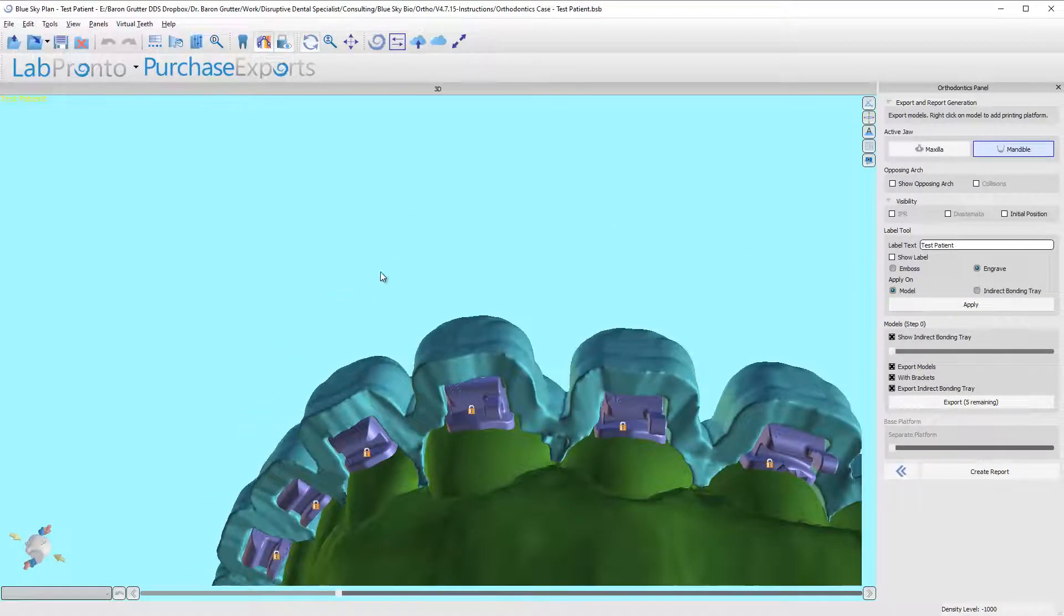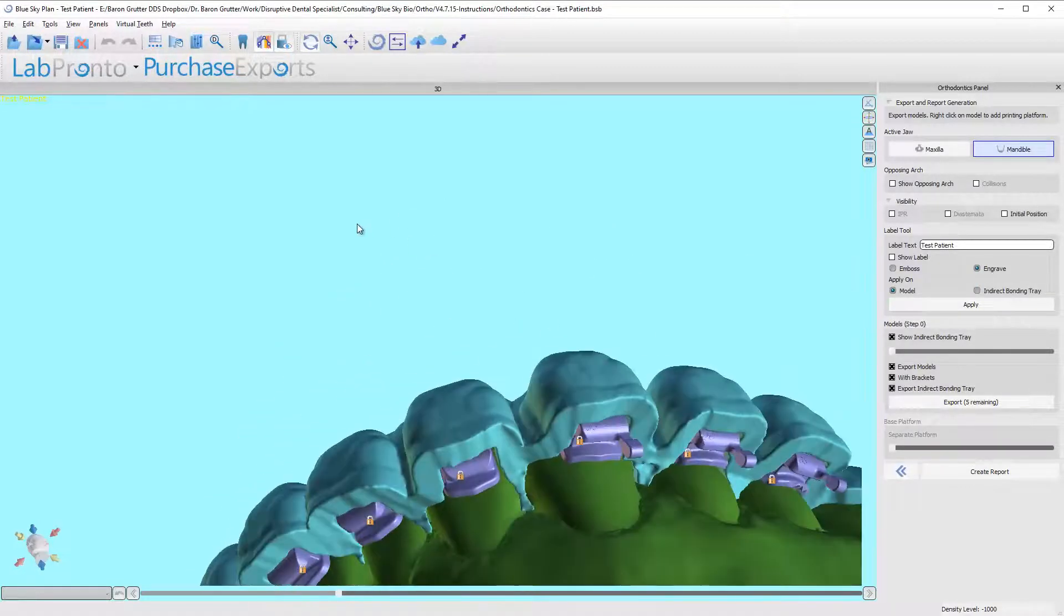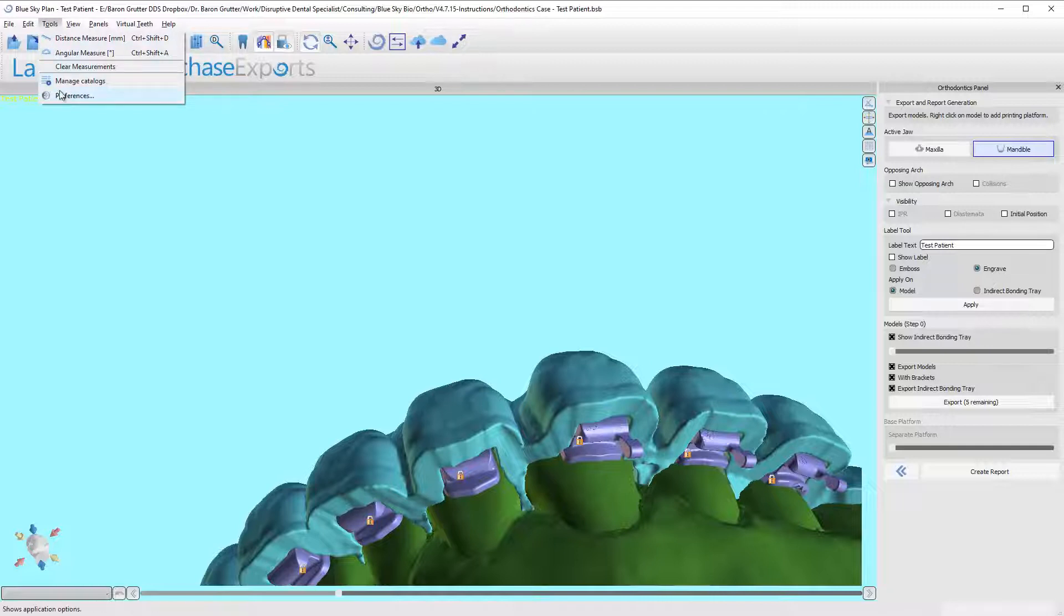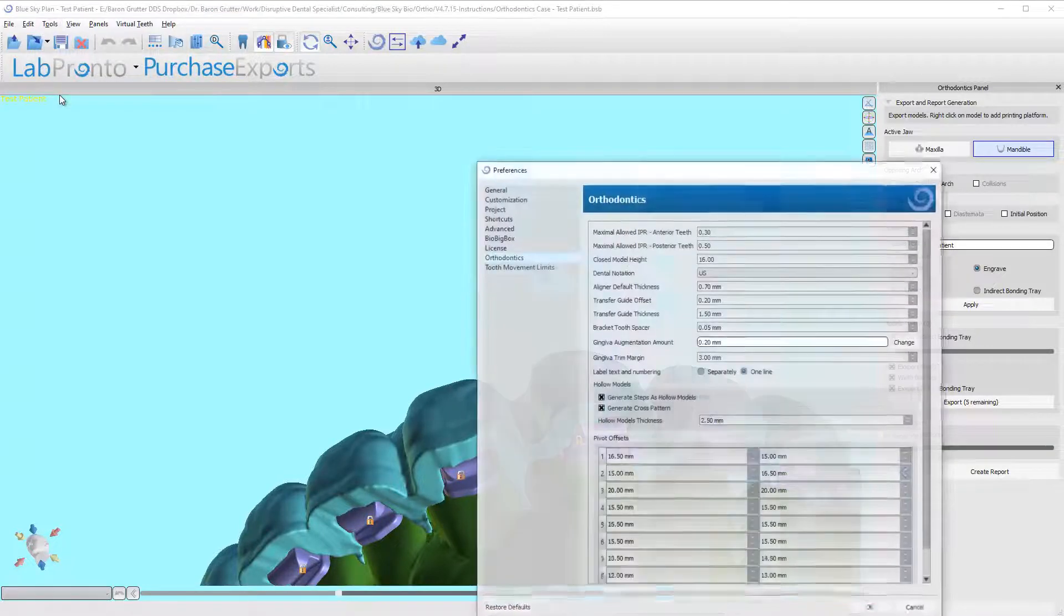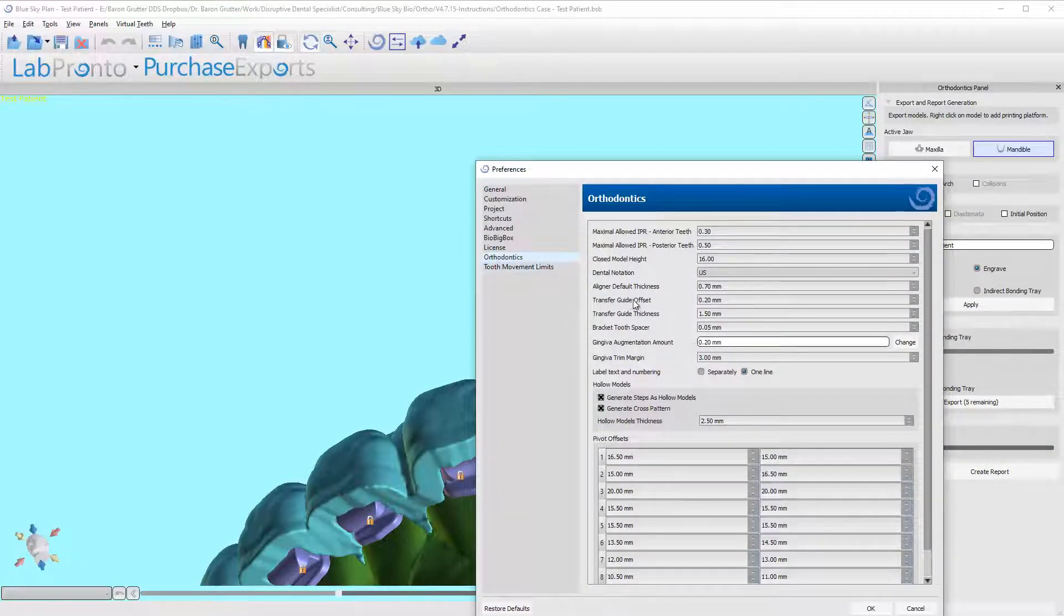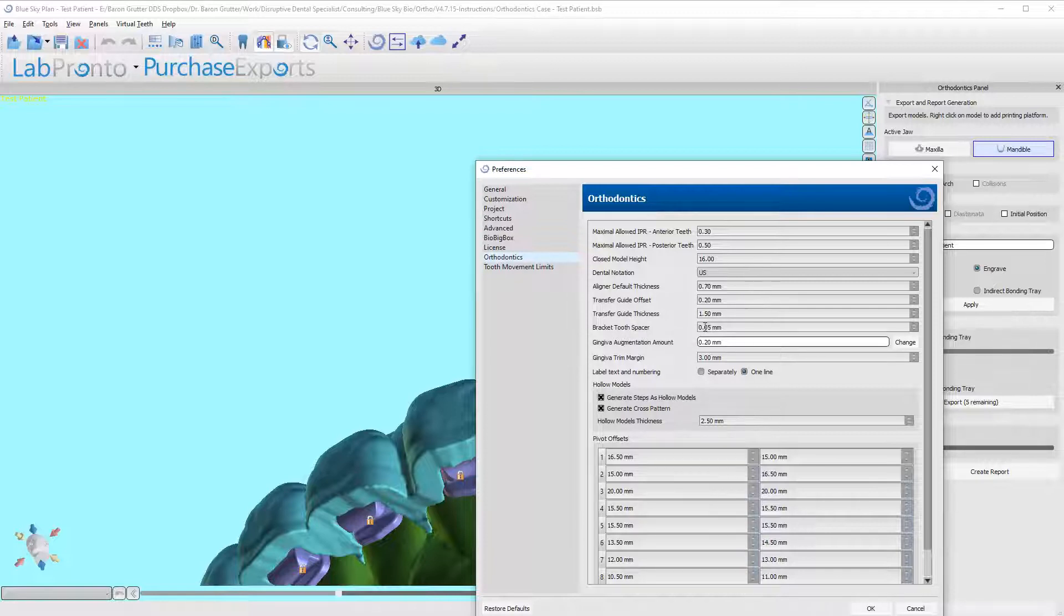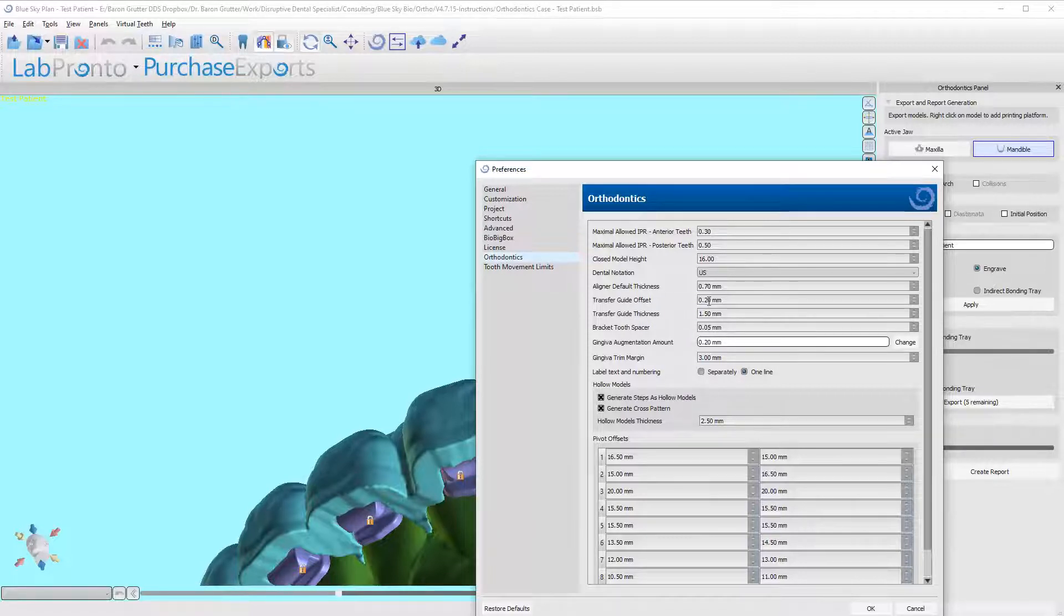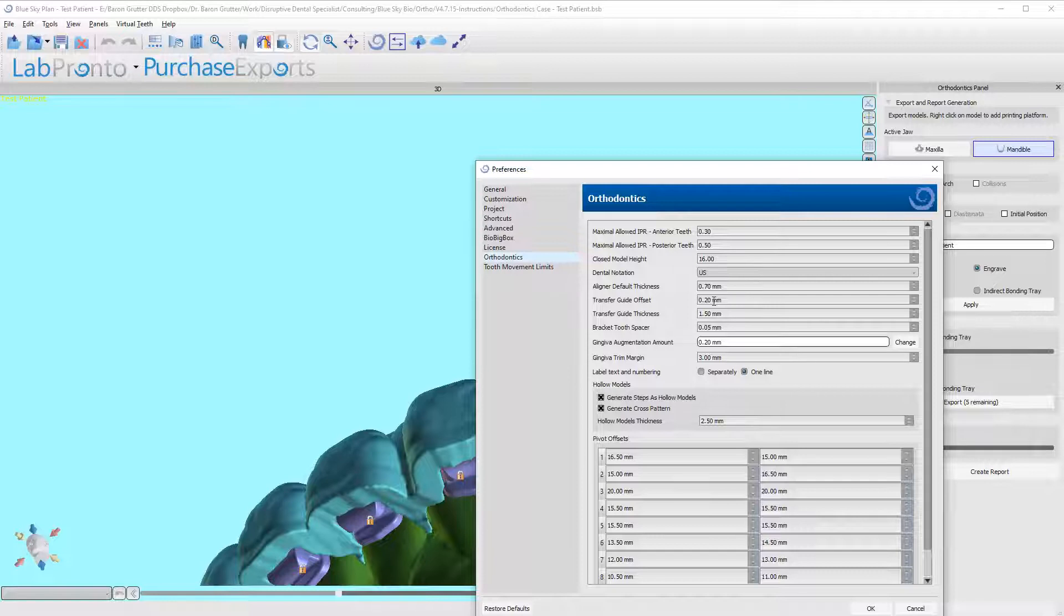I'm gonna come up to Tools, Preferences, Orthodontics, and now we're gonna look for bracket tooth spacer. So this is our shot at space from the tooth transfer guide offset—0.2 millimeters. So that is the space that is defaulted in the software.